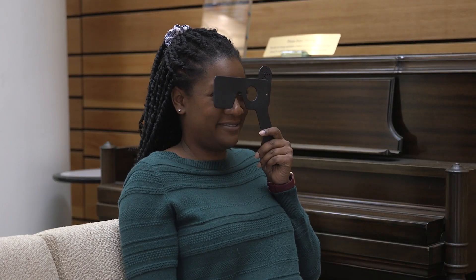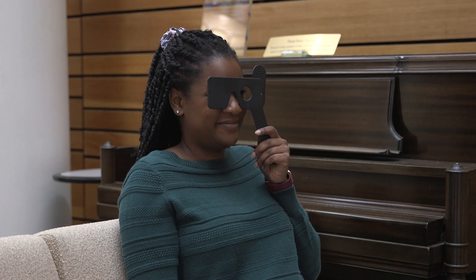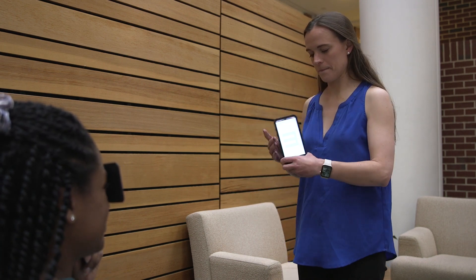Sometimes the participant cannot make out which direction the E is facing. If the participant does not know the direction, skip that E by shaking the phone. You will hear a noise when you have successfully skipped that E. When you are showing the participant the next E, prompt them to try again to tell you which direction it is facing. If they still cannot see which direction it is facing, shake the phone again to skip to the next direction. You may have to skip multiple E's before the participant is able to see the E well enough to tell you which direction it is facing.